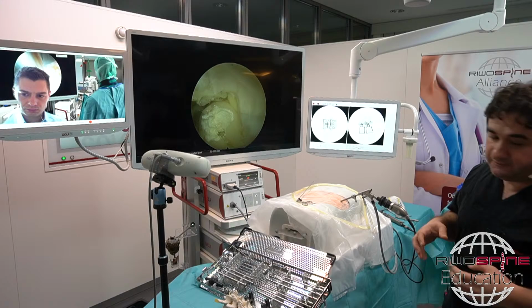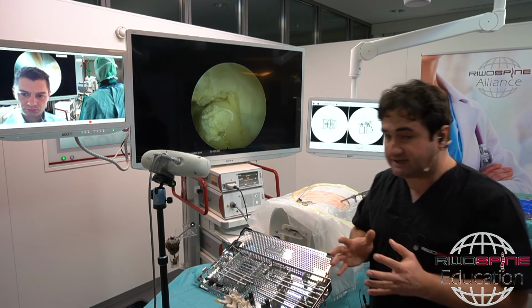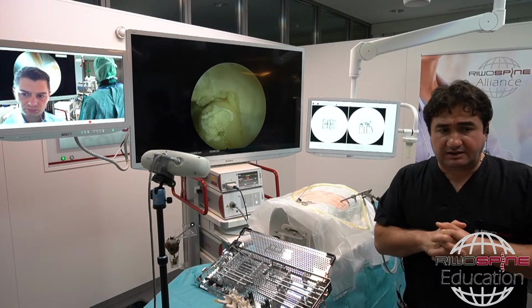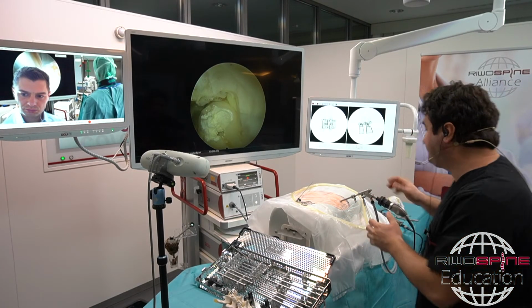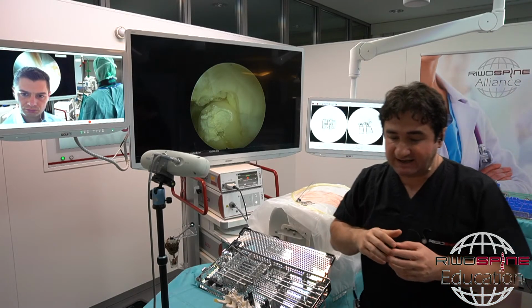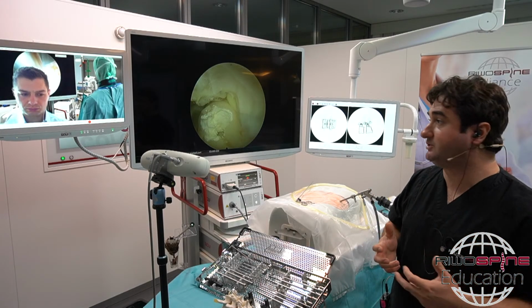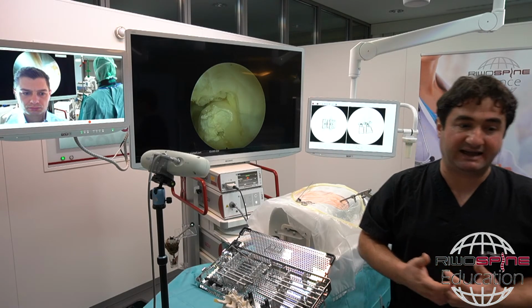But if you don't see any free space in the caudal side of the foramen due to the herniation, then you have to start at the junction of the caudal pedicle to the ascending facet. In this way, everything will be free. You will not get stuck in the foramen, and you have to control the sleeve and the instruments. That needs a little bit of experience.